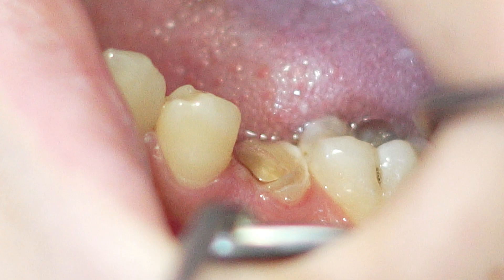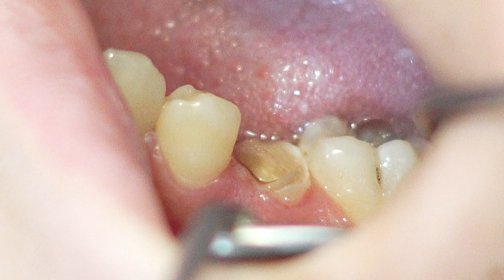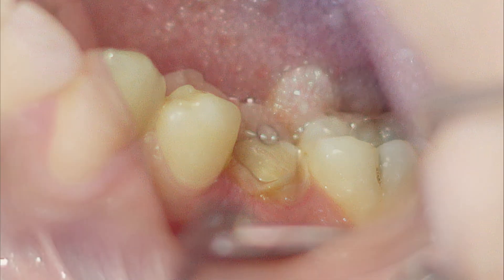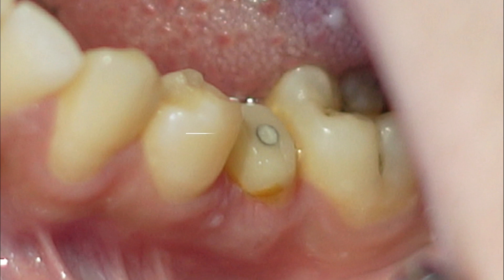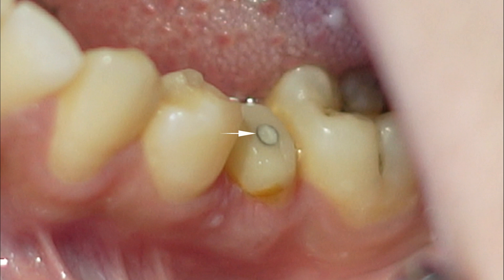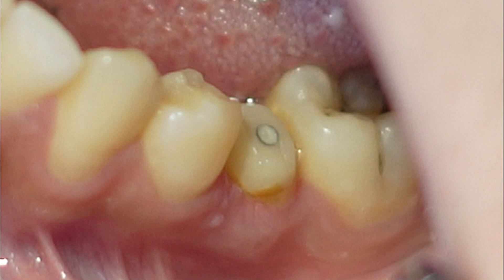This whole procedure — the endodontic procedure, root canal treatment, post and core system, and tooth preparation — is done in a single sitting. The final prosthetic crown is going to be placed after 2 days, once I receive it from the laboratory. Here you can see the lost tooth structure, almost all gone with only a small crown left. After completing the post and core procedure, I built a good amount of crown structure with the help of composites. The black marking here is pencil marking on the post so you can differentiate the post from the composite core material.